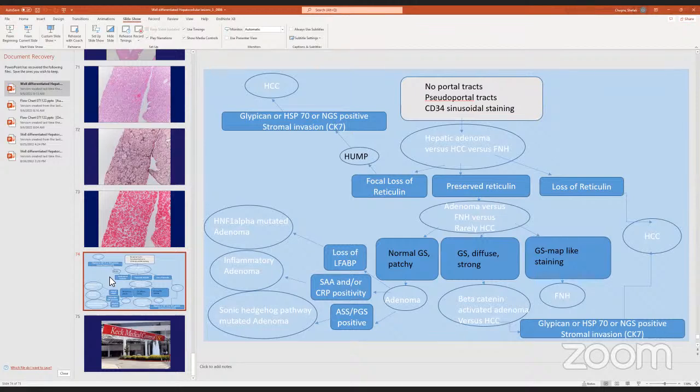And after 4 years or so, now there is a recurrence. The histology is very similar to what was before, and alpha fetoprotein is still normal. They did not resect it. So this time it was discussed in a tumor board, and they were still debating how to move forward with this patient's management.